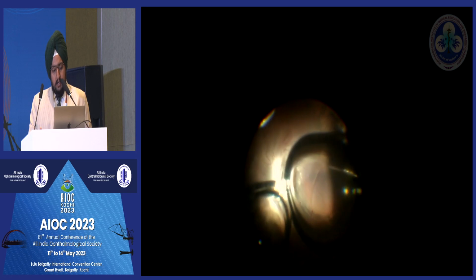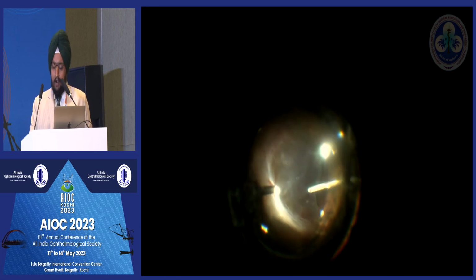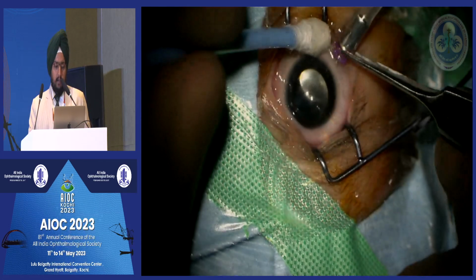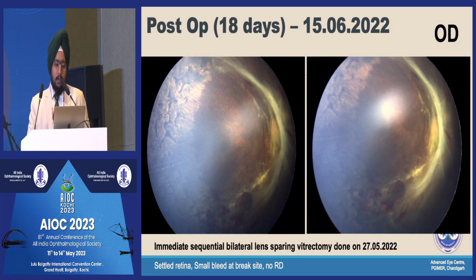We couldn't do much at this point of time because that break was right at the edge of the lifted retina where the traction planes were. So we decided to close for now, do a fluid air exchange, and came out of the eye. To our surprise, about 18 days later, once the air had gone away, the retina was completely settled.